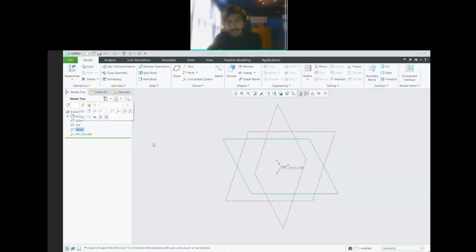If we look at our image, we have maybe you could call it some sort of exaggerated J shape, which is essentially what we're going for here. There are a couple different ways we can do that. I can showcase a couple different ways depending on how much you know about the part.